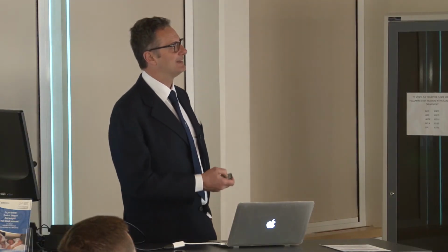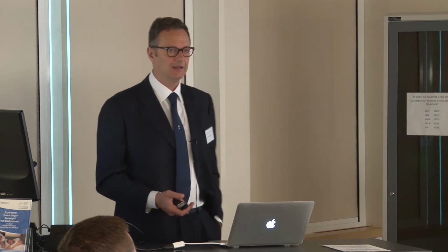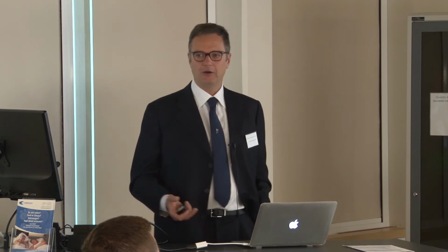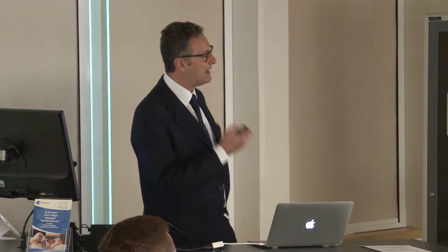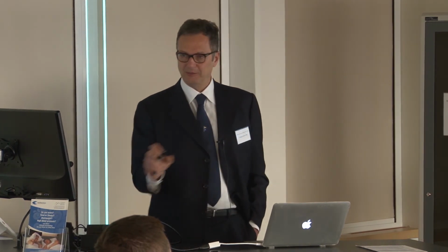Because if you have some fibrosis or scar tissue due to the biopsy, of course, you miss the information coming from the video stroboscopy and the hydrodissection. So you are obliged to perform a deeper resection. This is the reason why it's better to perform a very accurate workup instead of random biopsies.